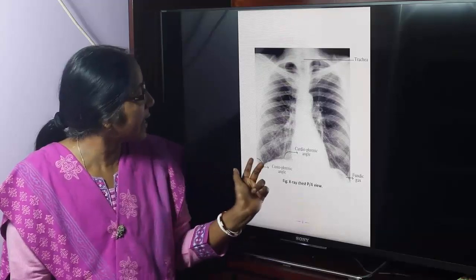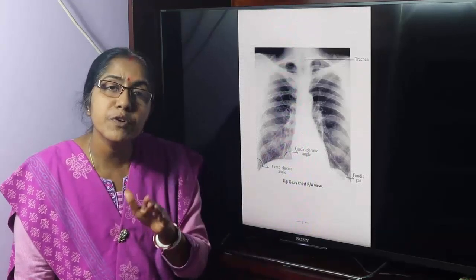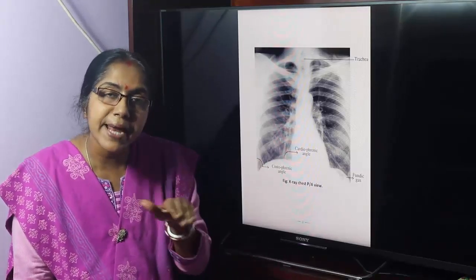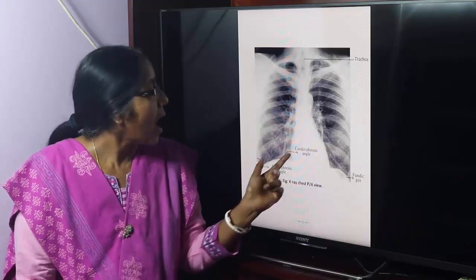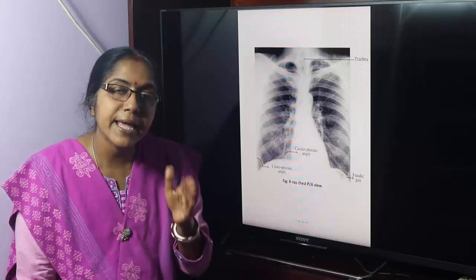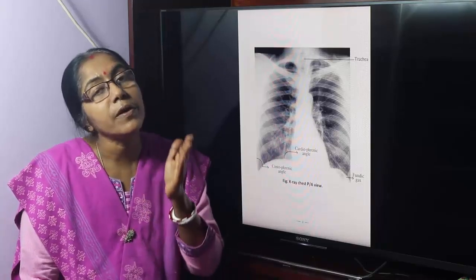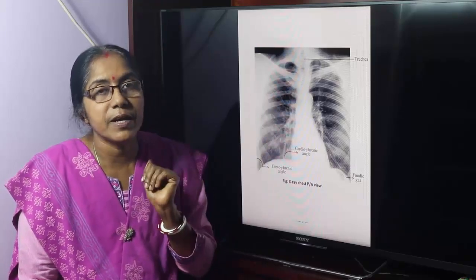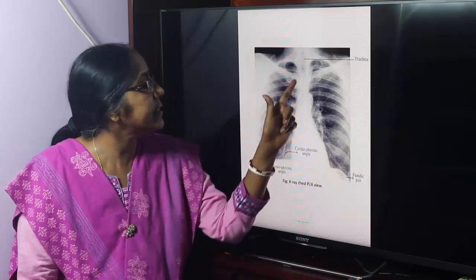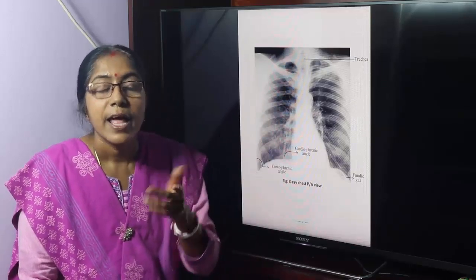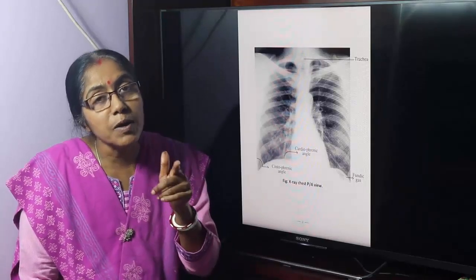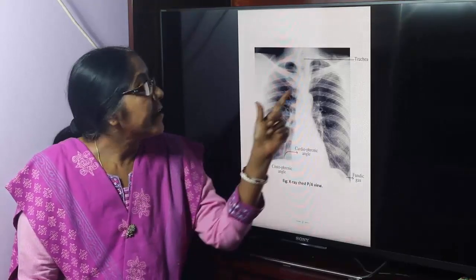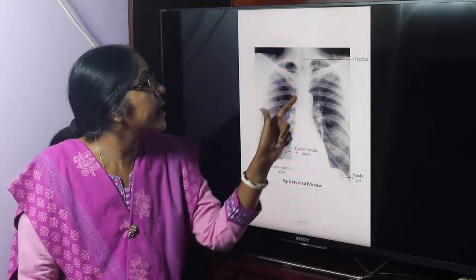This is the Cardiophrenic Angle and this is the Costophrenic Angle. Now, what do you mean by Cardiophrenic Angle and what do you mean by Costophrenic Angle? The angle between the rib and the diaphragm is the Costophrenic Angle, and the Cardiophrenic Angle is the angle between the heart and the diaphragm.